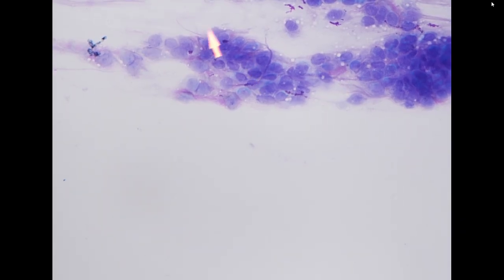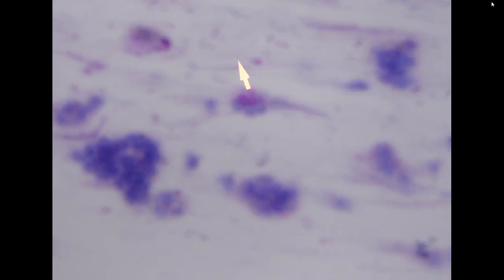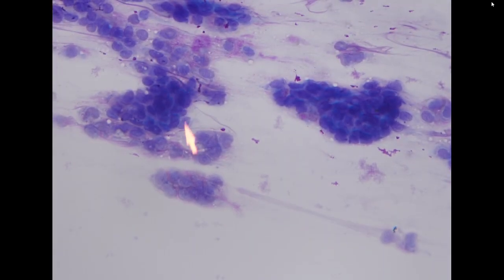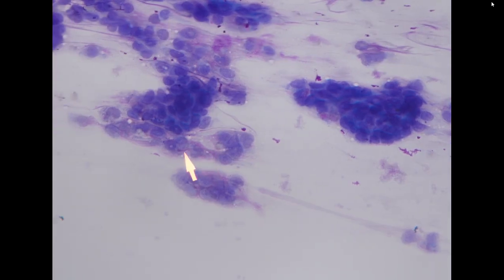So you want to see that they are intermingled within this matrix material, and it's fibrillary in character. So it is very fibrillary, and it is intermingled with myoepithelial cells. So this would be the diagnostic feature for the pleomorphic adenoma.